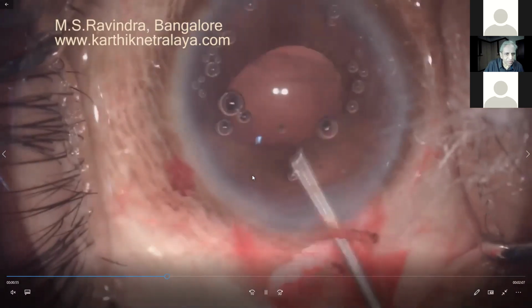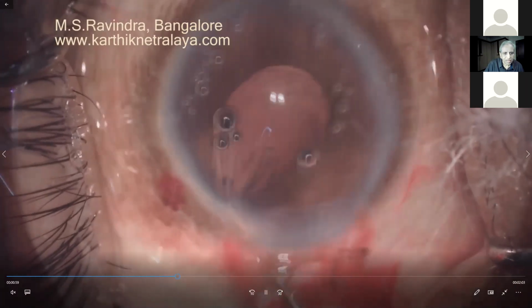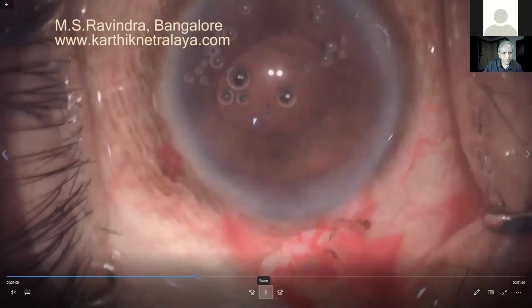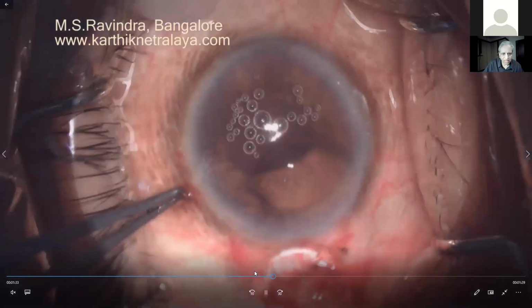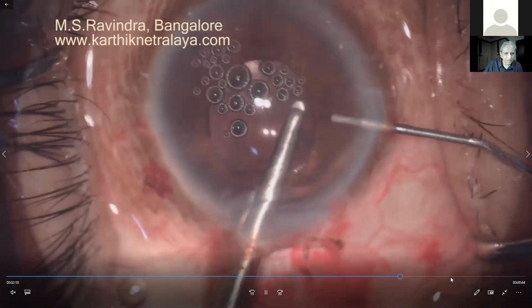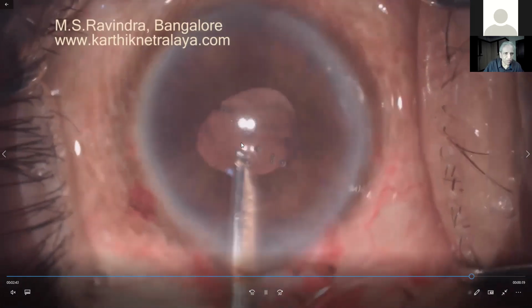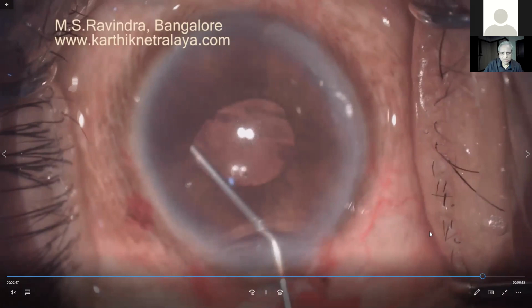Now I'm inspecting all the corners just to see if there is any cortex hidden anywhere. It's very important to remove. Here I prefer to do iris claw lens, as you can see here. I'll go fast here. That's not my intention to show the iris claw lens. I do examine it by injecting some amount of triamcinolone, which is diluted 1:1, and there's no vitreous fibrils, and that's the end of surgery. Let me just show you the second case.